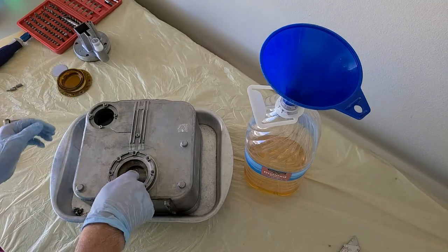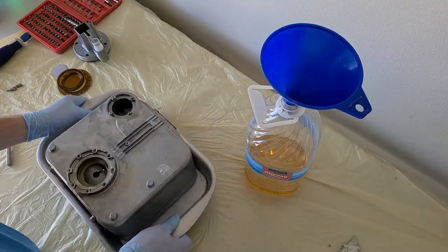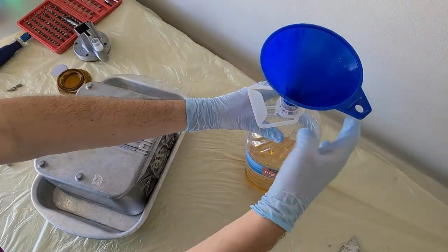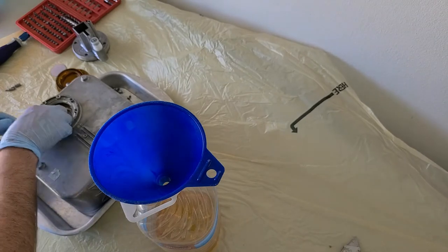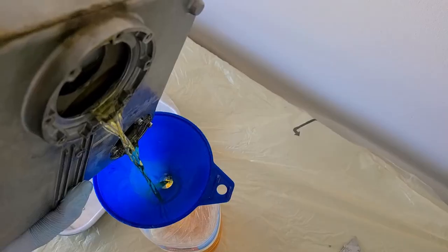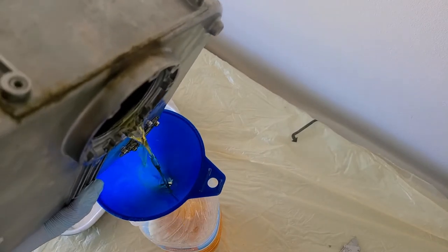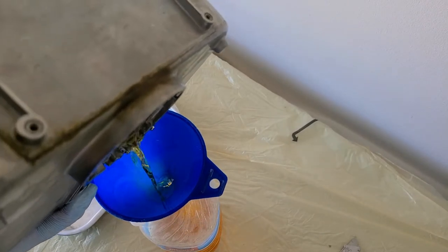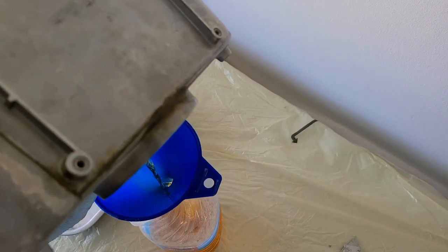Oh shit. Underneath that plastic. But now I should be able to get my oil out a lot better since it has that air vent. So let's go ahead and get the rest of the oil out. I'm going to bring this oil in somewhere for recycling. It's like a special kind of oil that needs to be disposed of properly.